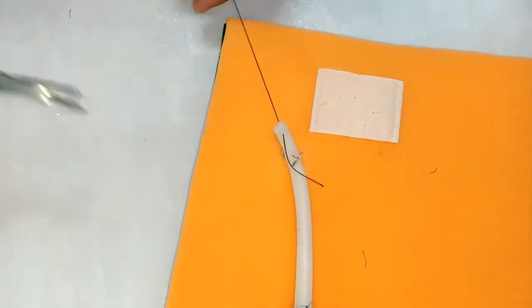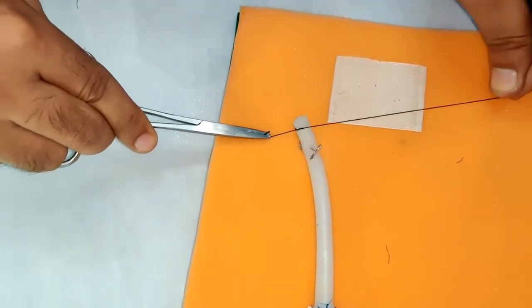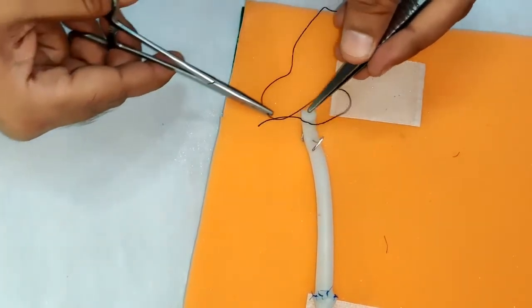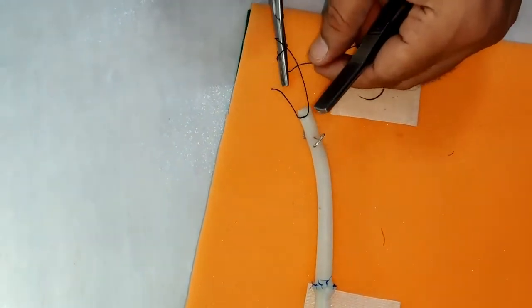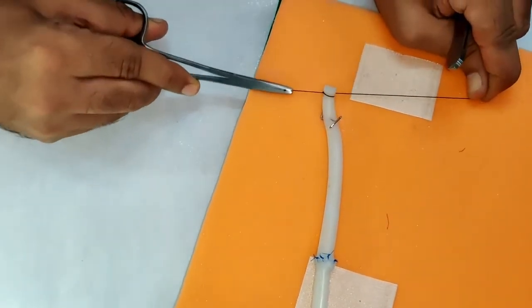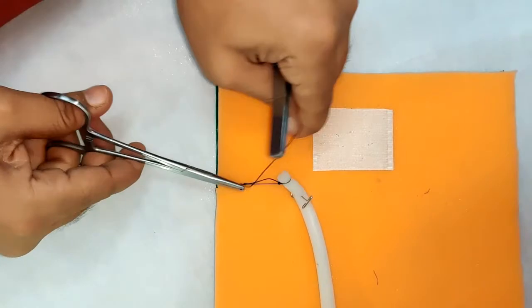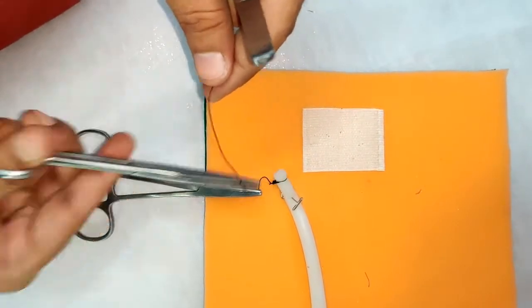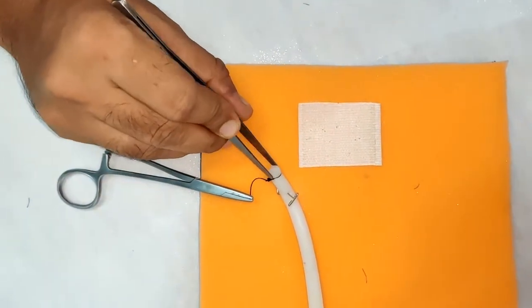On one side you will tie it, and then again pass your thread below the pedicle, and again you will tie it. This gives proper compression on the pedicle. We will then cut the thread. You can see how the end has been crushed from both sides.